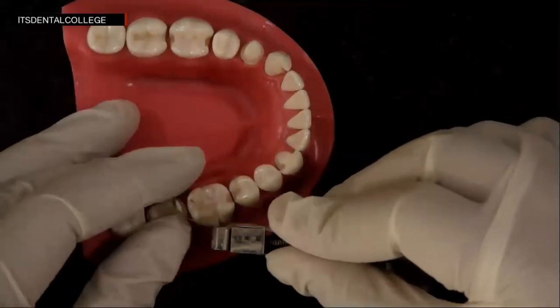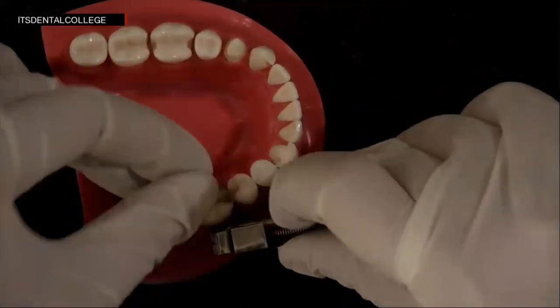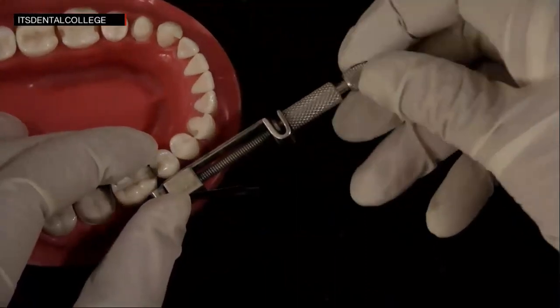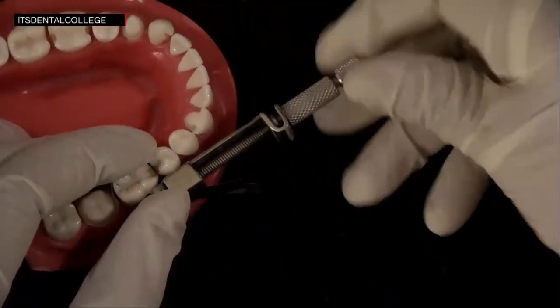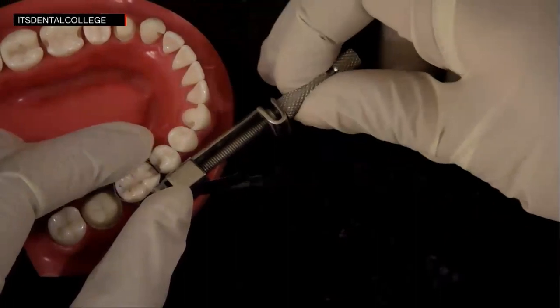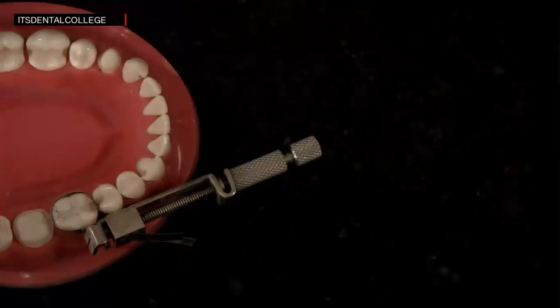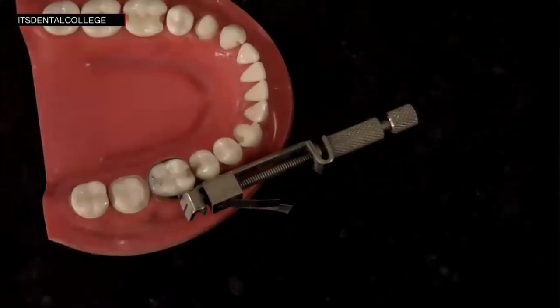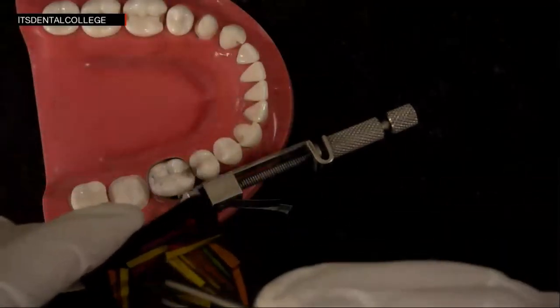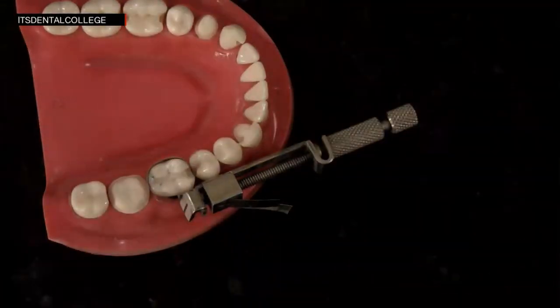So the band will encircle the tooth circumferentially with the slot facing gingivally. And then we'll have to tighten the screws, the smaller one and then the larger one. Okay. After which we have to place a wedge. The wedge has to be placed from the lingual aspect, and the base of the wedge will always face gingivally.